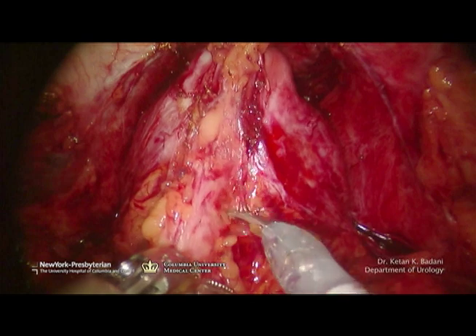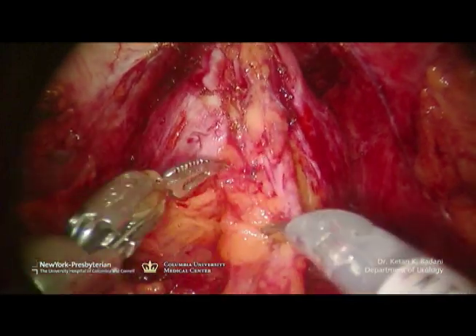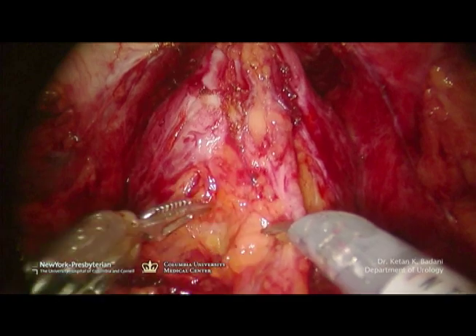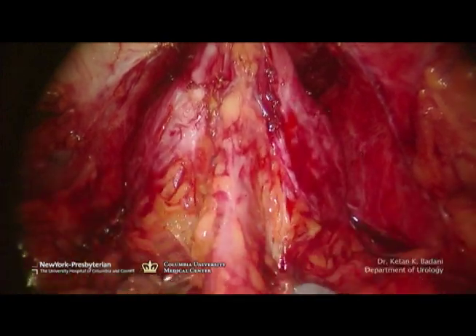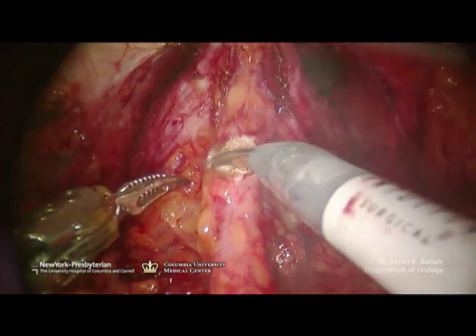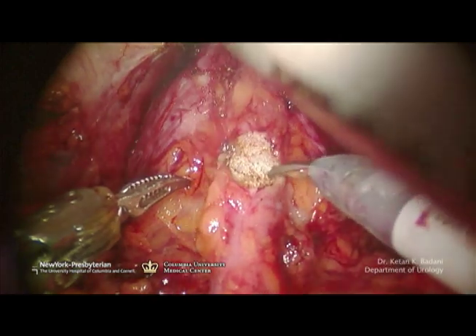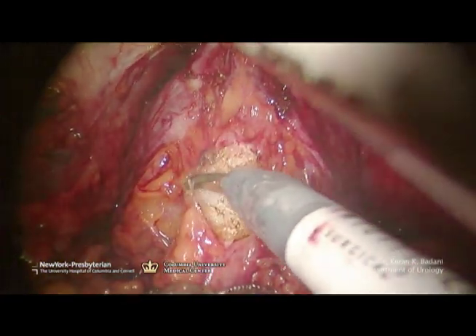Identification of the bladder neck. Here I've switched to a 30-degree downward-facing lens, and I'm identifying the prostato-vesical junction. My fourth arm is giving cephalad traction of the bladder, and my Foley balloon has been deflated. This junction is easily seen now, with the bladder entering directly into the prostate. I find this to be the easiest way to identify this junction.